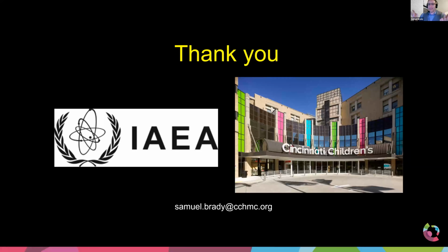And so that's why with deep learning and iterative reconstruction, we can do it both ways. We can improve the image quality and get what we need without changing the dose, or we could keep the image quality where we're at and drop the dose some more. But I have some slides on that. We'll go over that in a minute.